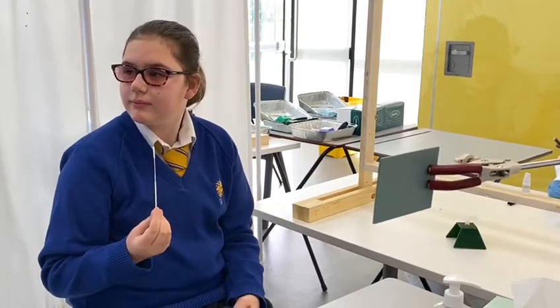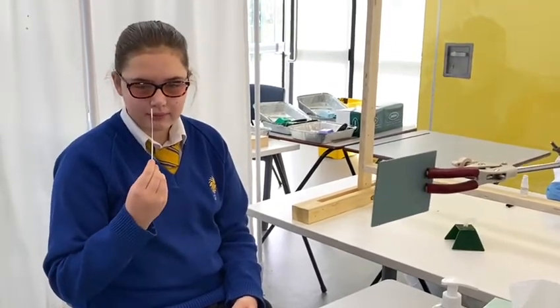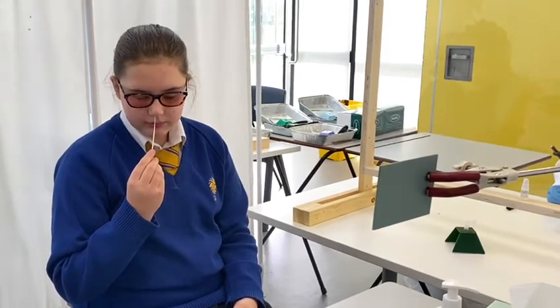And then we like to glide the swab up one of your nostrils so you feel some resistance and twist it ten times.